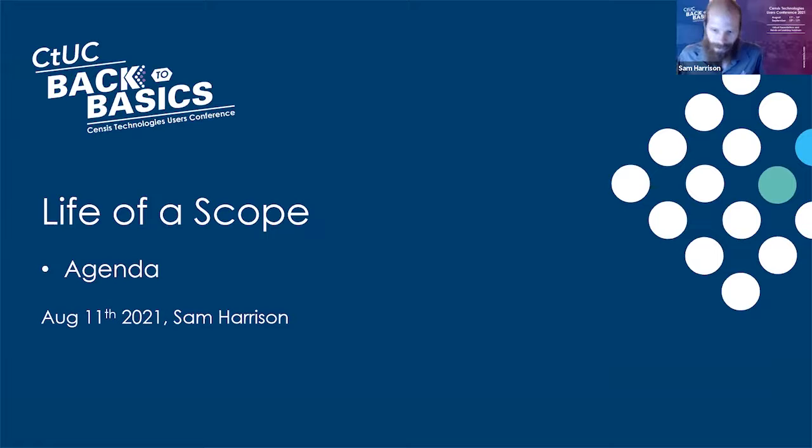What we're going to be talking about in this session today is the fundamentals of CtTrac. Basically, what I'm hoping to communicate with you all is the very basics of CtTrac at the elementary level. I want to break it down for somebody that's never seen this before.